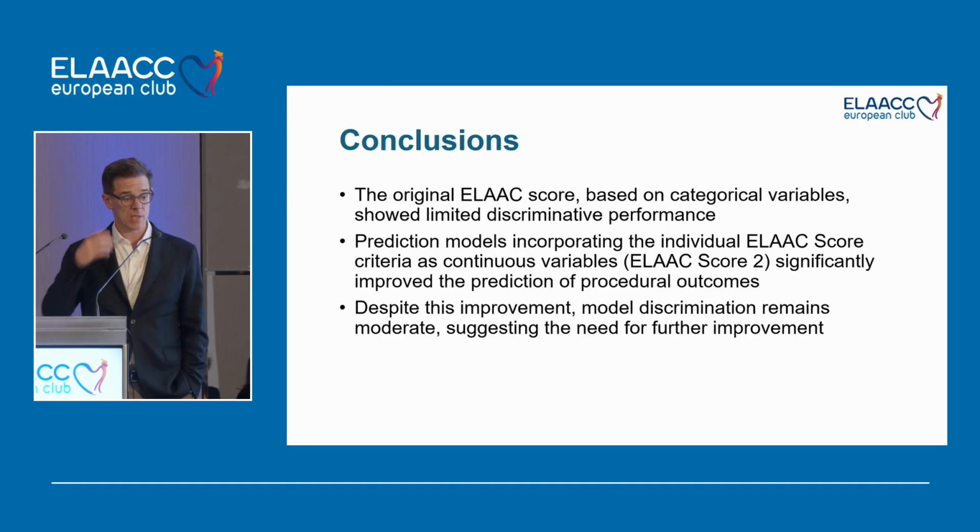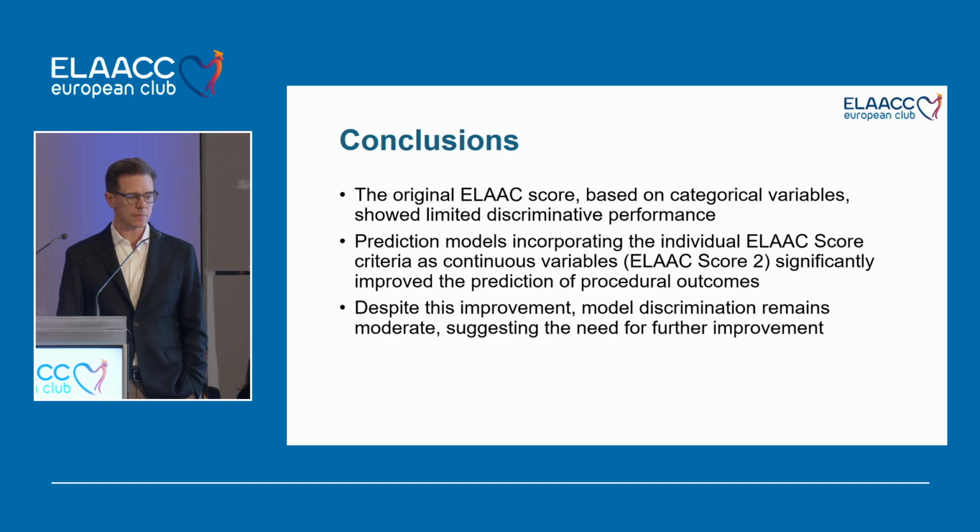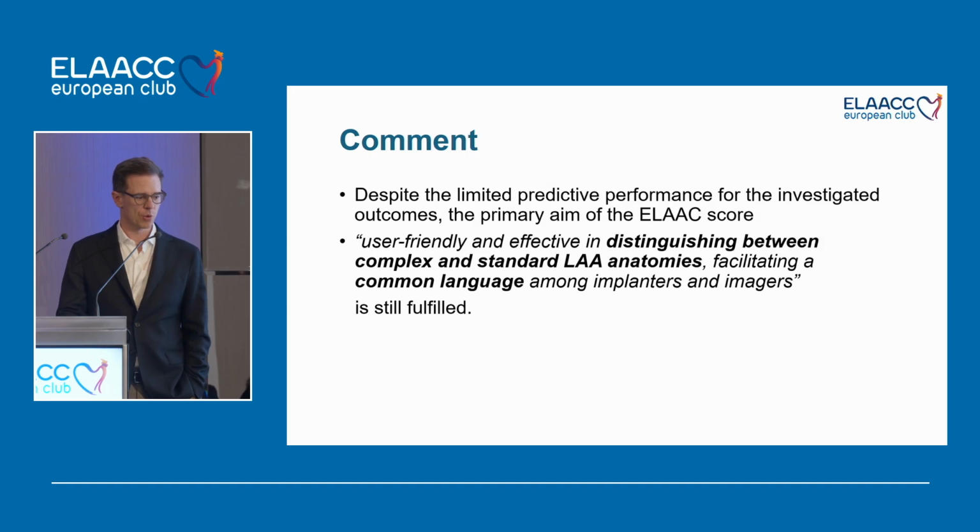The prediction models incorporating the individual ELAACC score criteria as continuous variables significantly improved the prediction of procedural outcomes, but despite the improvement, the model discrimination remains moderate, suggesting that we still have room to improve it. I would like also to make a comment.